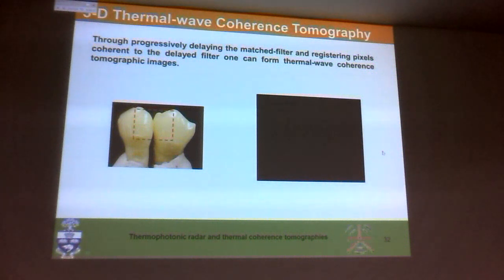But on the other hand, if you give them this kind of solution, they can actually pass it on to their assistant, somebody who can do the remineralization process, and because there's no x-ray here, they can call the patient every month or so to monitor the degree of remineralization, because it just takes more images every month. And every time you go, you pay. And if you can get a code, then your insurance is going to pay. So this is where we're at right now.